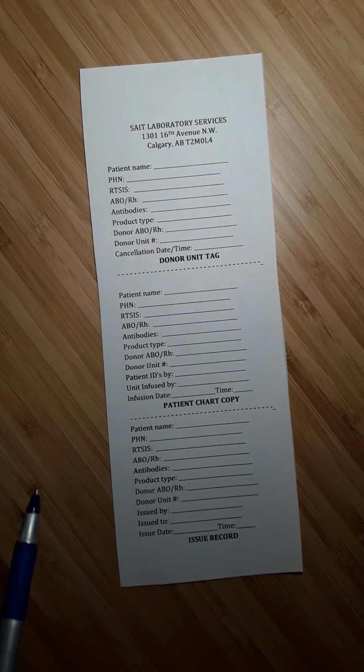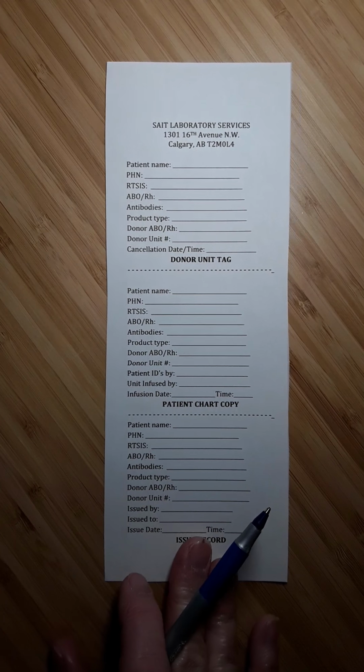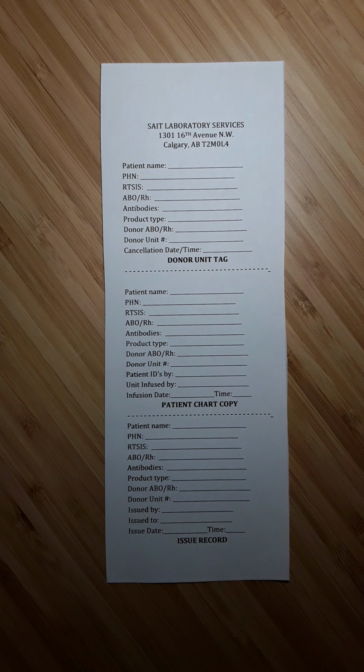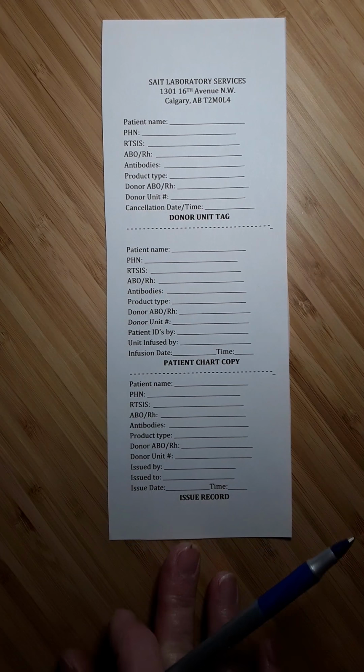Now, when you do a cross-match on a patient in the Millennium system, it will automatically generate a tag on your tag printer in your transfusion medicine department. Here at SAIT, we don't have a tag printer, so we make our tags manually. But this is a very, very similar tag to the one that prints on the tag printer.